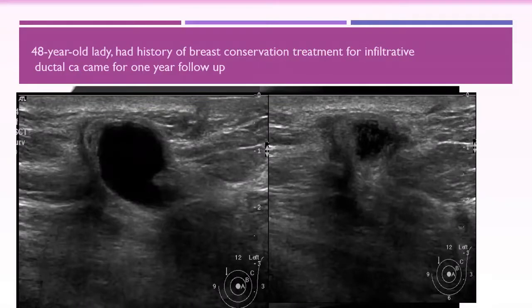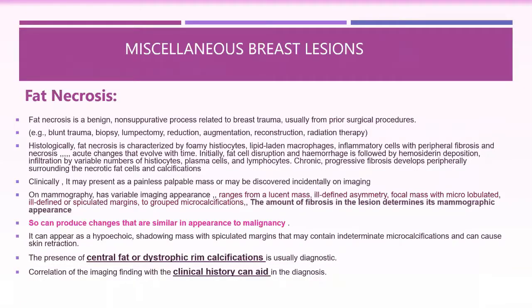Seroma, yes, but not a simple seroma. It is fat necrosis filling the seroma cavity.